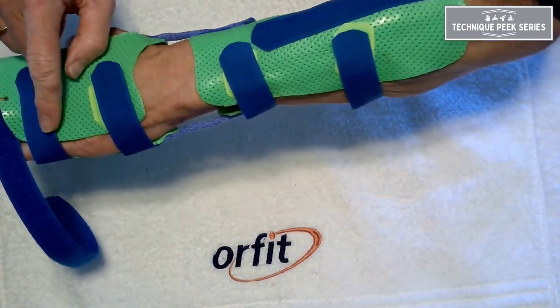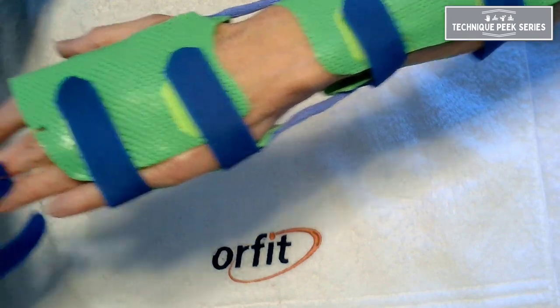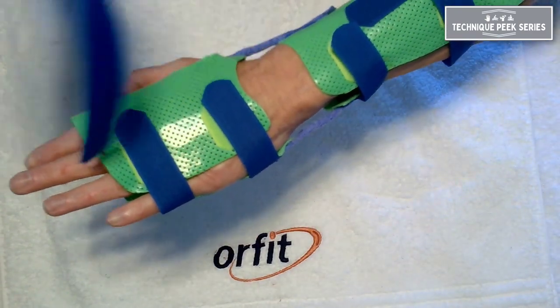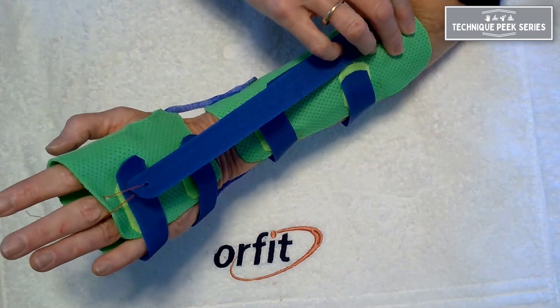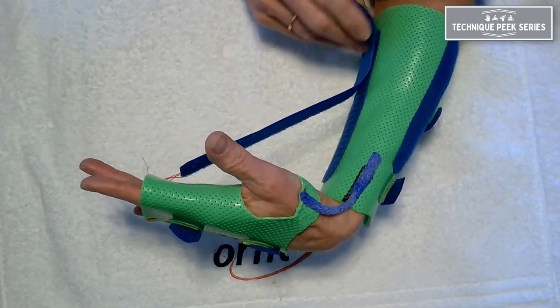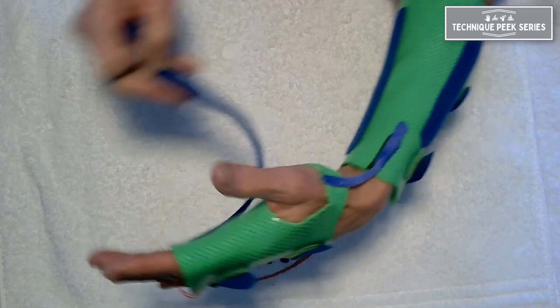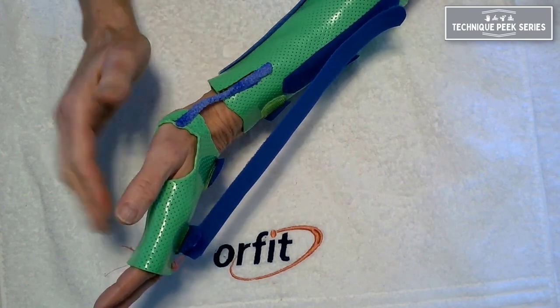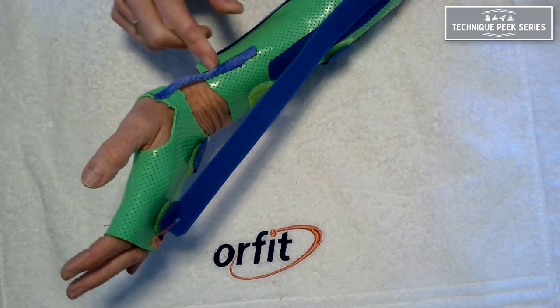With a little hole punched between the fingers and some thread, I've created a method for pulling — I want this between my ring and middle fingers. I've attached it to a long strap of velcro loop, and I can pull into wrist extension or wrist flexion with the same orthosis and the same static progressive pull. The hinges maintain the same distance throughout the entire range of motion, so there's no need to go back and adjust that 90-degree angle of pull on the metacarpals as long as you've got this distance maintained.